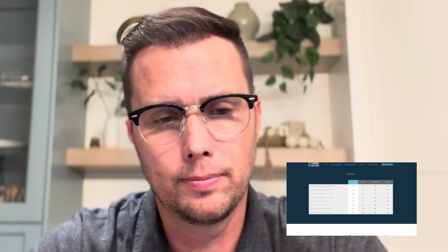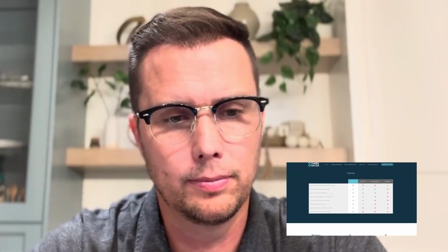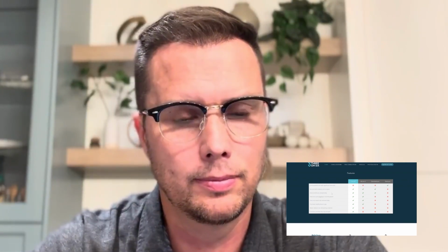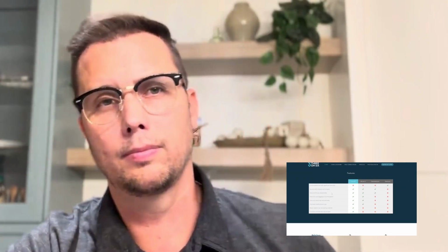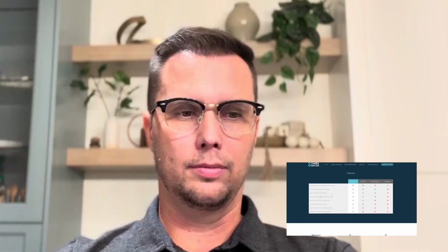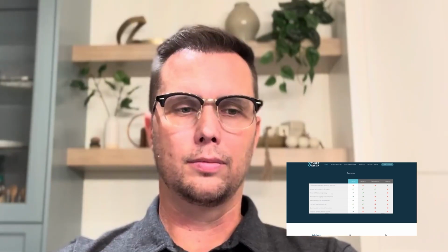Then, if we scroll down to the features part on the website, these features tables are so common, you'll see them on so many websites. My biggest problem is that the questions they ask are heavily skewed towards the system that they're trying to promote. If you look at the All-on-4 column versus the 3-on-6 column, you'll see they're very similar, but it says here that the 3-on-6 never needs to be removed by a dentist. I would completely disagree with this.